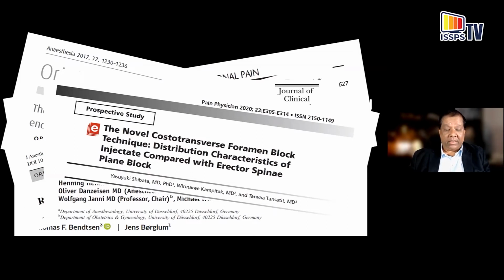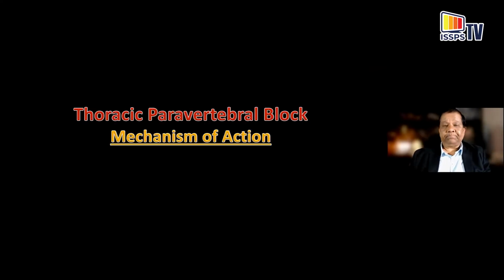So if you take the concept they've described, actually the costotransverse foramina does not exist because of the space behind the superior costotransverse ligament complex. Okay, I'm going to leave it at that.